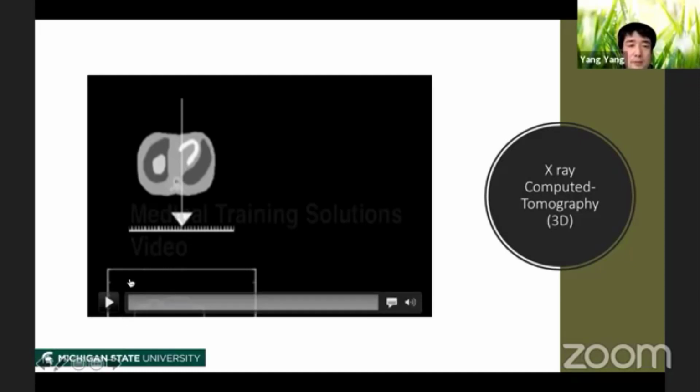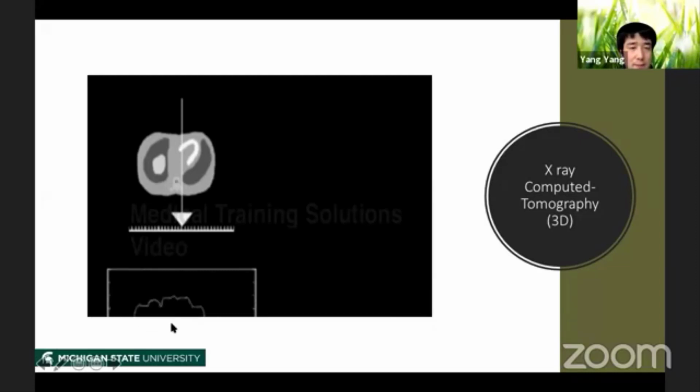Now, at the bottom of this illustration, this curve shows the accumulation of X-rays. So when more X-rays pass through, you have a higher accumulation. And when fewer X-rays pass through, you have a lower accumulation.